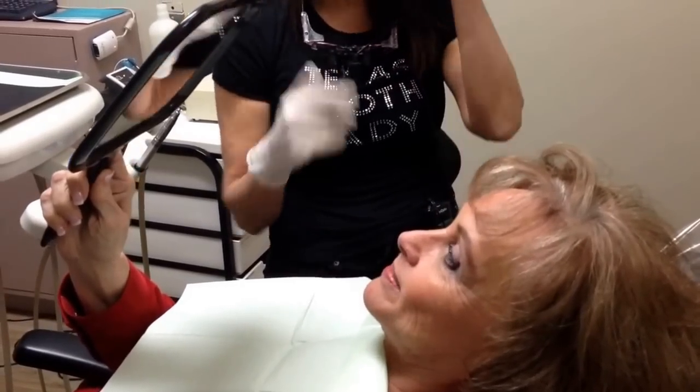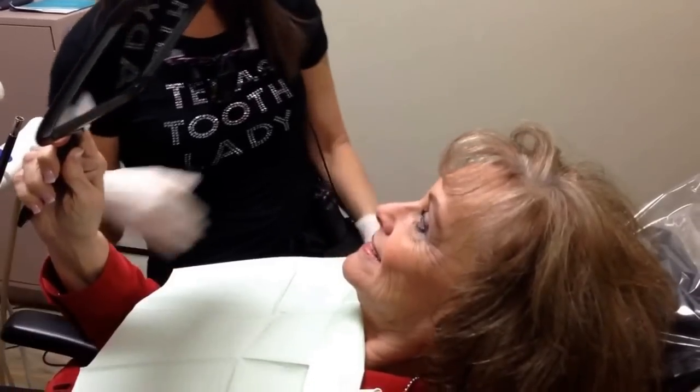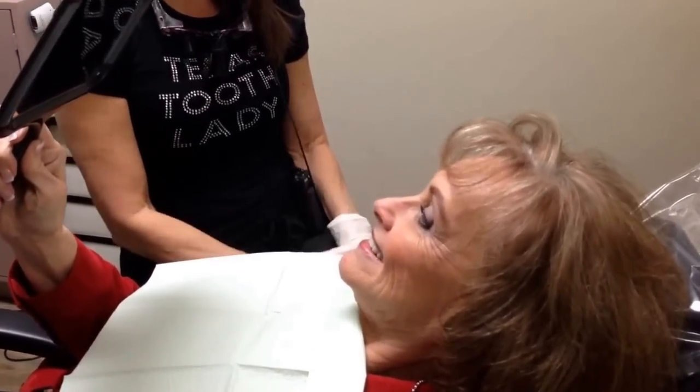Very natural. I think the color is perfect for you, because they actually match your lower teeth — a little lighter, but nice change. Yes, I love them. They totally look real. They actually look like veneers. This is actually one of my favorite cases. Just wonderful. You can't even tell they're in. No. I love them. Yay.